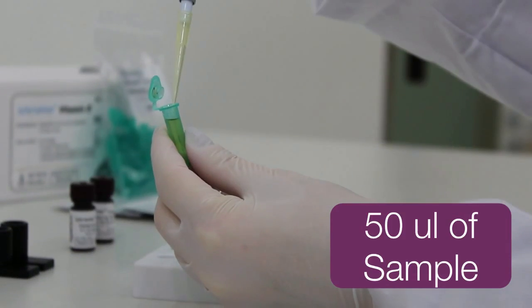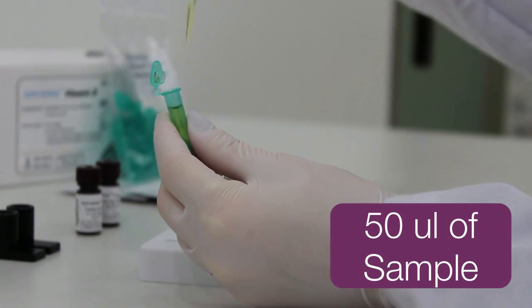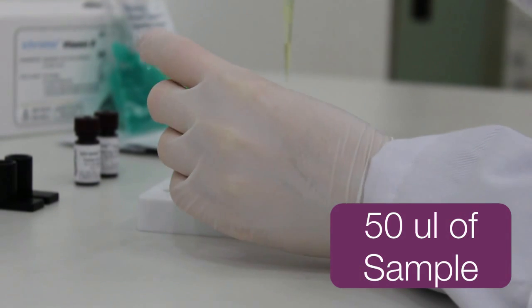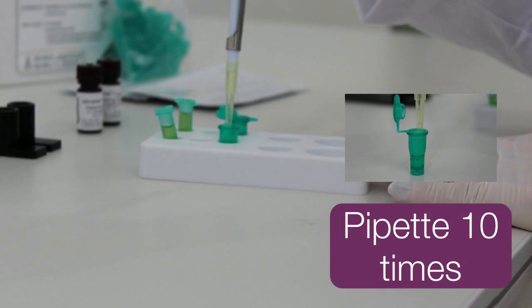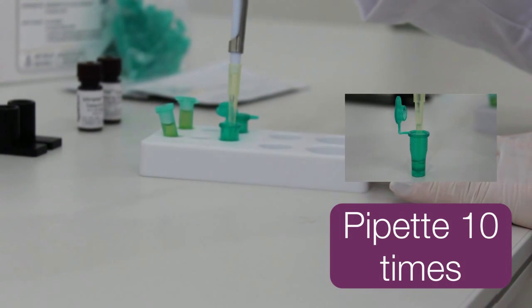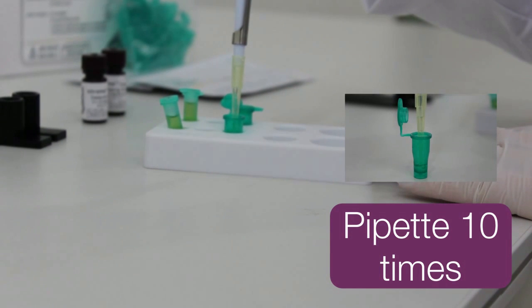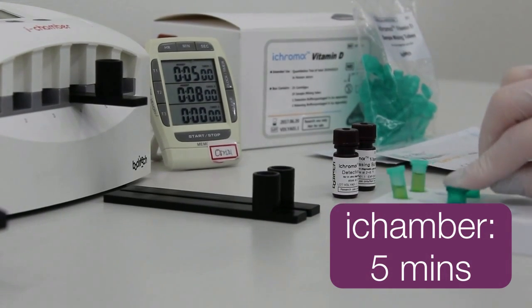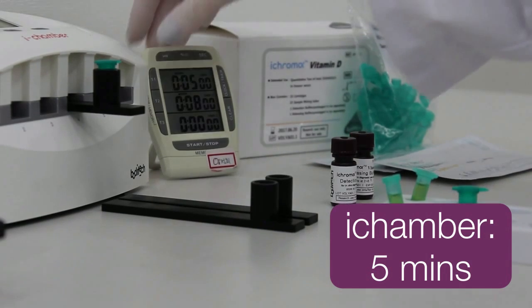Transfer 50 microliters of the sample using a new tip to the sample mixing tube containing releasing buffer and mix well by pipetting 10 times. Leave the sample loaded tube in the incubating tube block at 35 degrees Celsius for 5 minutes.